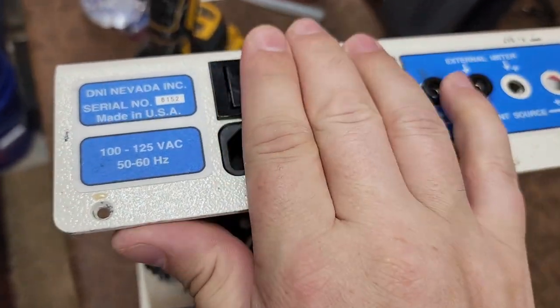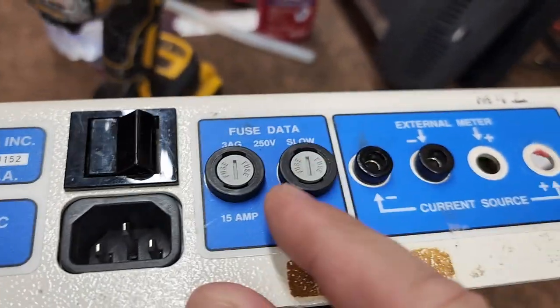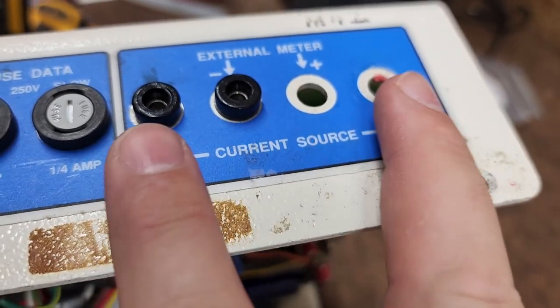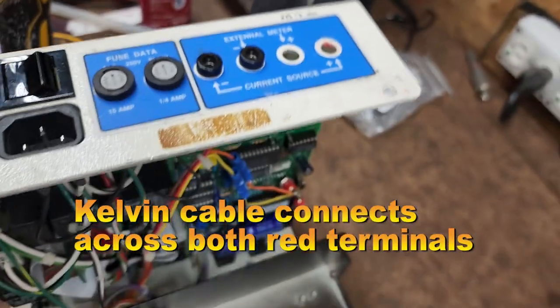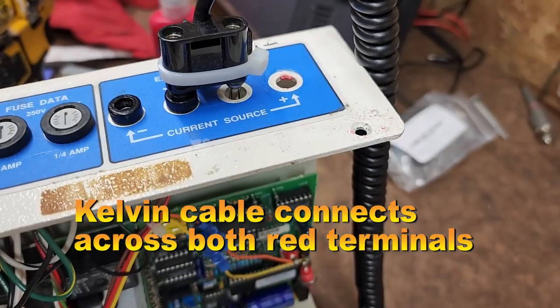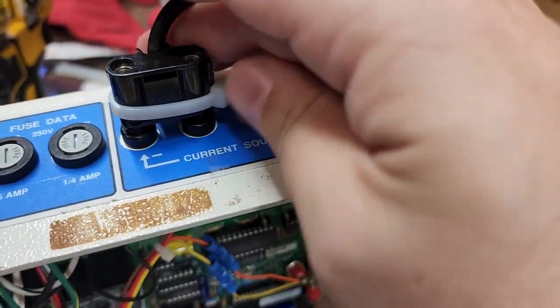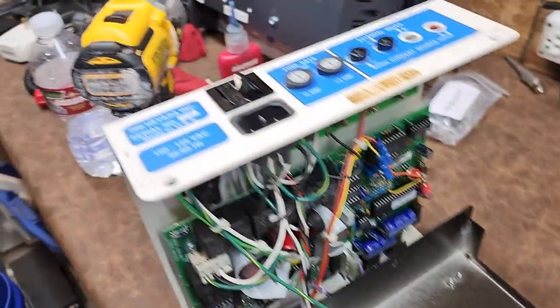This is your master or mains power switch. They were very smart: they have a 15-amp fuse right here. You do have fuses up here for external meter and for current source. When you measure, you normally measure between these two pins with the Kelvin cable. It has been a while since I've used this device and this older-style Kelvin cable, but this will go between a couple of pins and you're off and running. I'll do some research before I hook it up and start checking things.